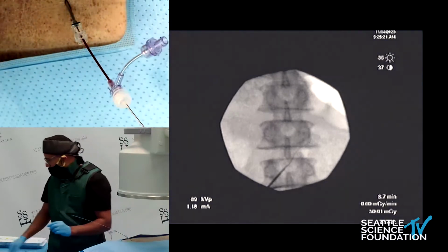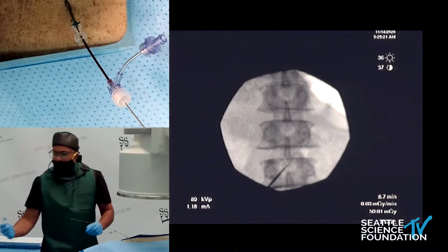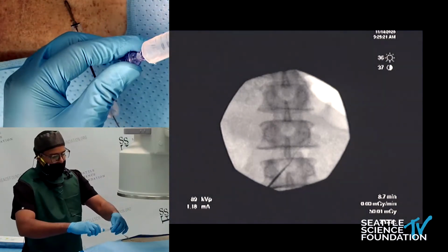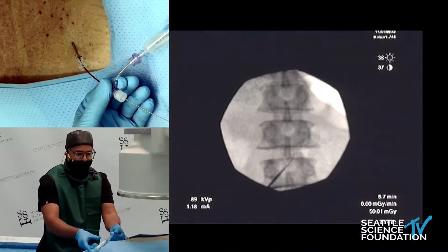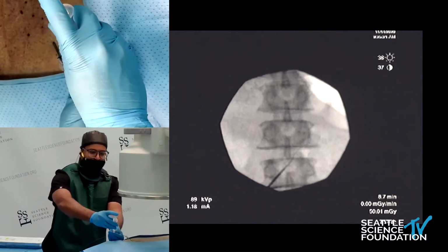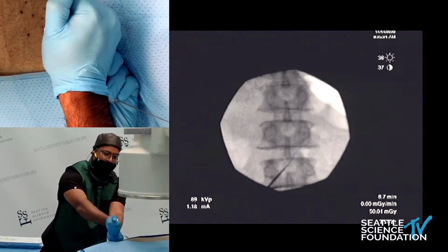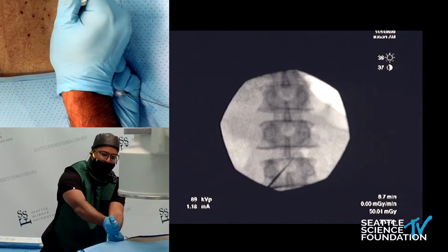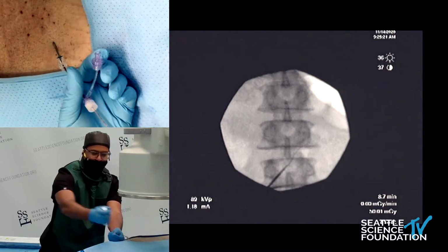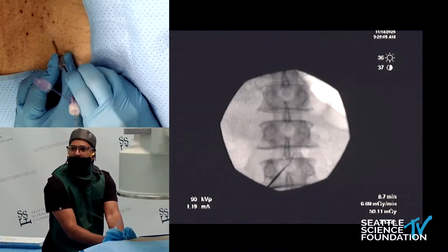And then another technique is to get a little saline here. And just like I mentioned before, reduce the friction. Make sure that hub is really tight, because otherwise you're going to shoot saline back at you in the face, and that's not pretty. Those are not good style points. So we'll just inject a little bit. And I can tell just by the pressure here that it is pretty tough in there. And so you can see some of the fluid backing out because it's really tight, and that's okay. It's just what we have to deal with. And then we'll try once again.